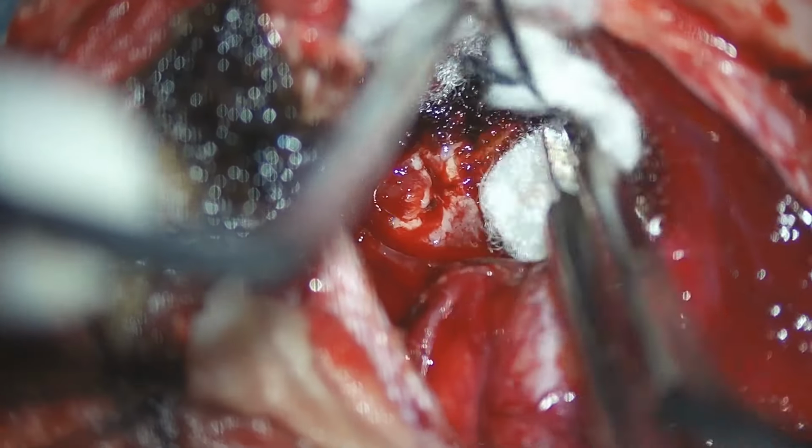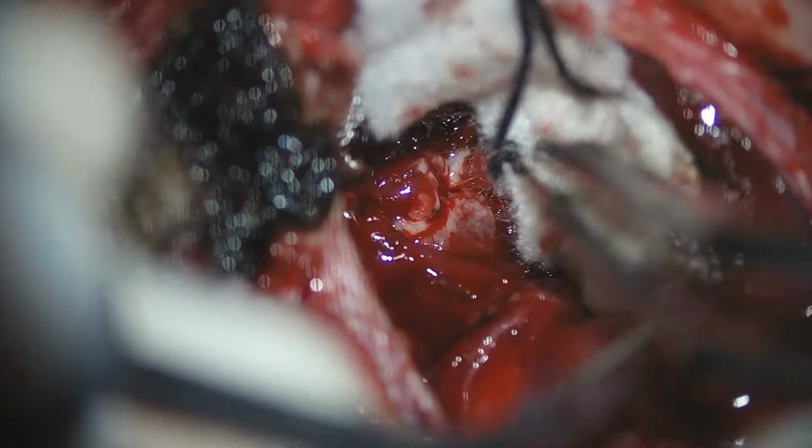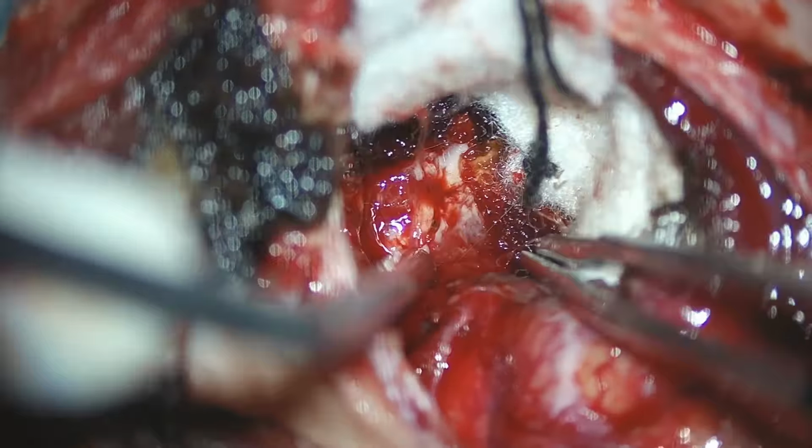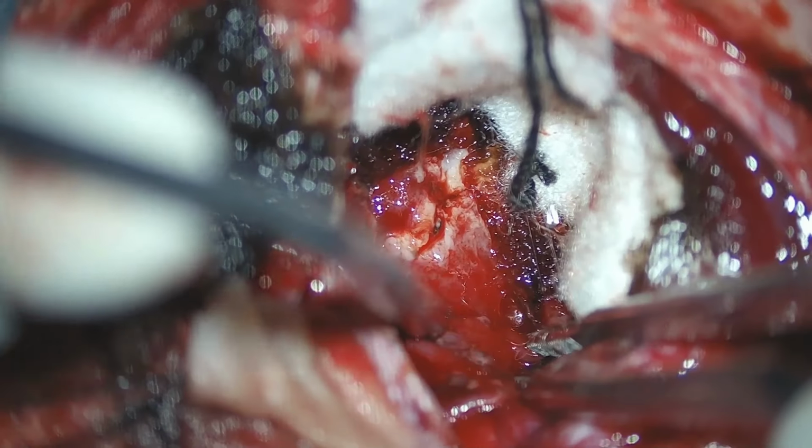After packing with Surgicel, we see that there is no further bleeding, and we pack it with dry cottonoids, which are removed later after the surgery.